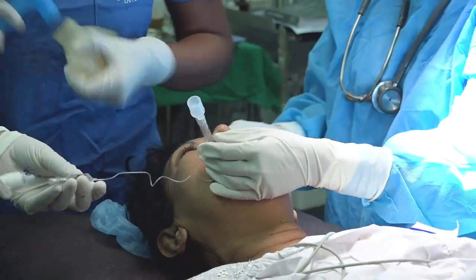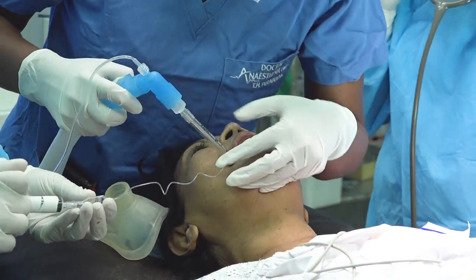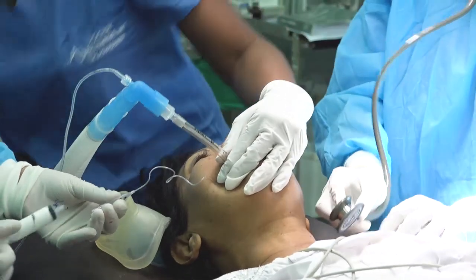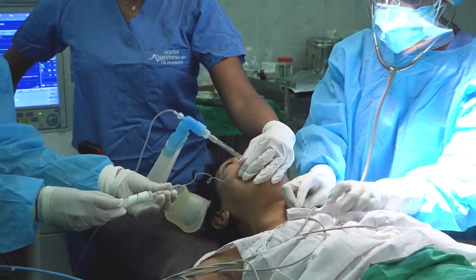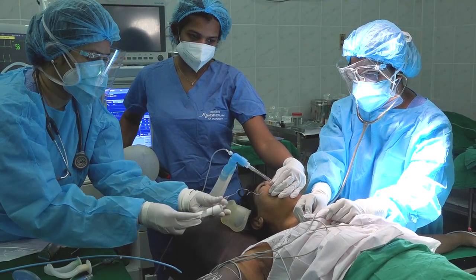So in this learning session, we learned how to intubate. We learned the correct technique and how to maintain vital parameters and to maintain 100% oxygenation in between intubation attempts.